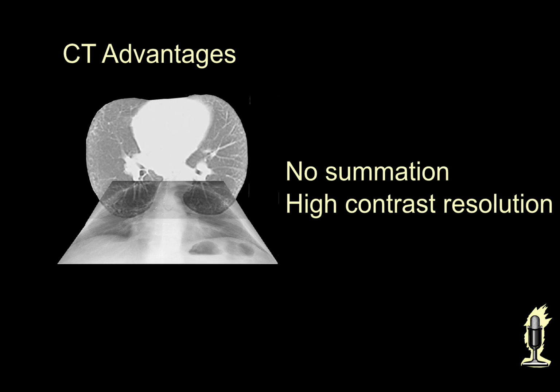CT has two advantages over chest radiography in the evaluation of diffuse lung disease: lack of summation and the inherent high contrast sensitivity of CT.